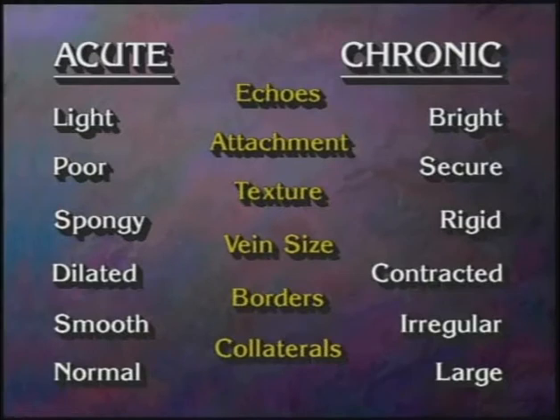These distinguishing characteristics are not absolute. They are, however, useful tools in estimating the age of a thrombus and the risk of its embolization. Since clot dissolution, with lytic therapy or spontaneous lysis by the body's own thrombolytic system, may occur in some cases of venous thrombosis instead of simple stabilization and contraction, all clots may not follow a predictable pattern of aging.